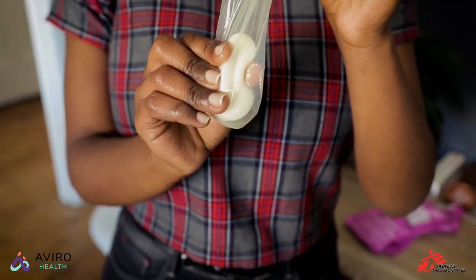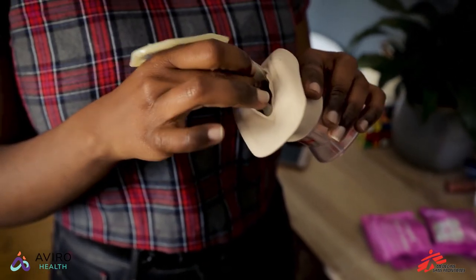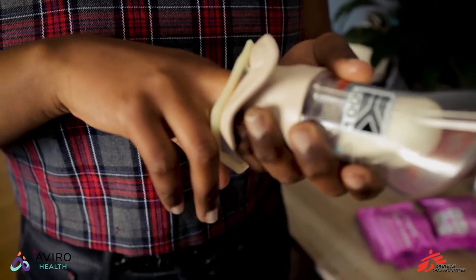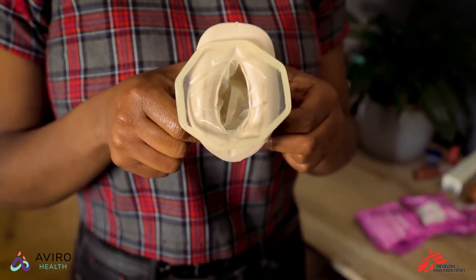Now squeeze the sponge and condom at the top to make it long and guide it into your vagina. Once it's inside, use your finger inside the condom to push it into place as far as it's willing to go. The outside ring should always stay on the outside around your lips.